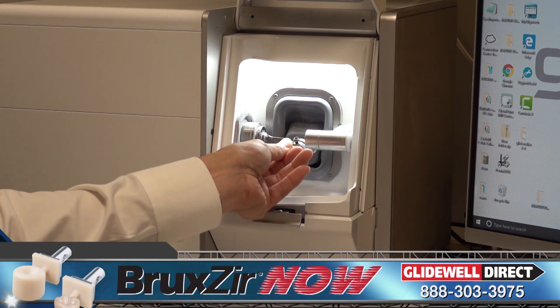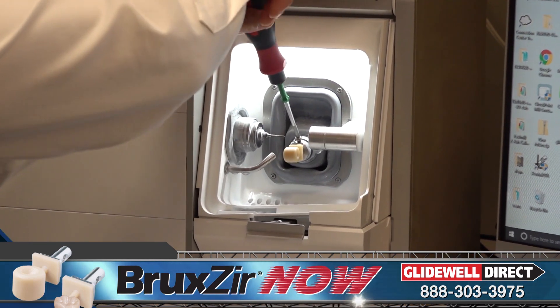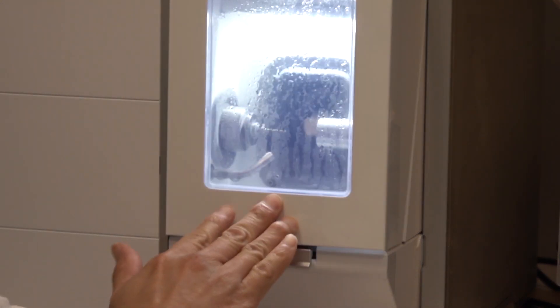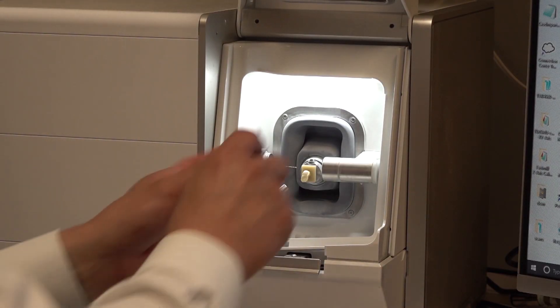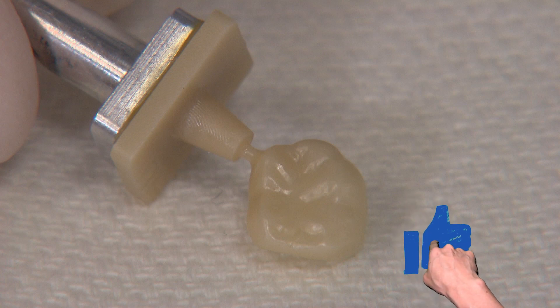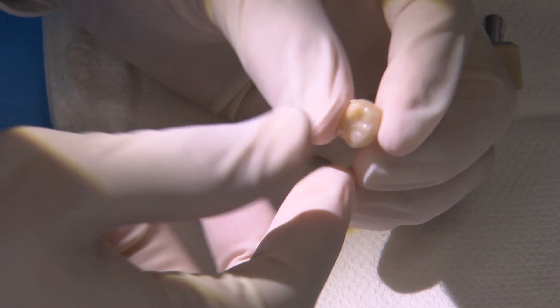When the design is completed, I load and lock in a Bruxer Now block within the block holder and seat a new diamond bur in the mill collet. Because Bruxer Now is a fully sintered zirconia, each block comes with a new single-use diamond bur specially designed for this purpose. In only 35 minutes, the fully electric fast mill completes the crown. The sprue connection between the crown and the rest of the block is also reduced in size by the mill so users can easily snap the crown off.